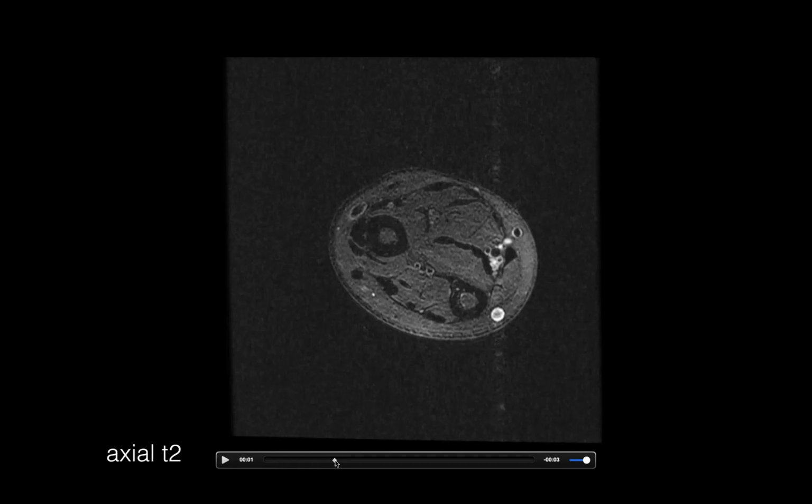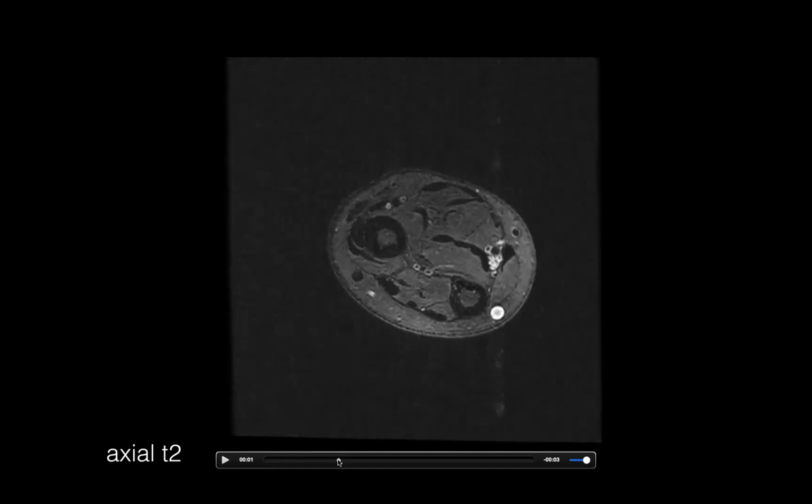Is it blood flow? Yeah, it's a blood vessel. And what's a little bit interesting about this is that this is not an artery. You would think it'd be an artery based upon this pulsation artifact. It's a vein, right? So I think this vein had some pulsatile flow in it as well. And I know it's a vein because there's just not a normal artery out in that location.